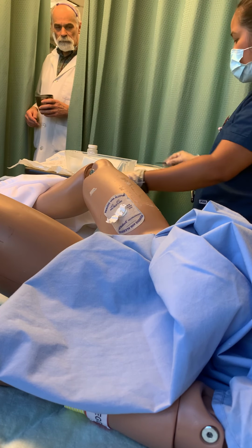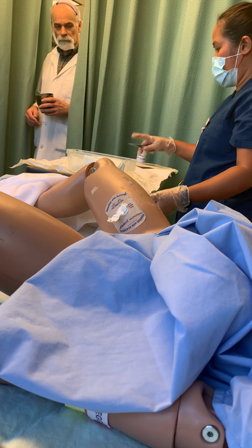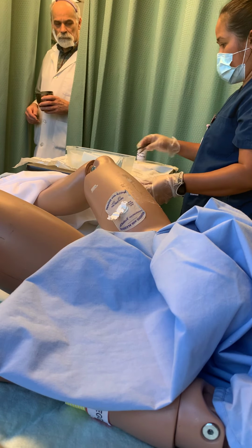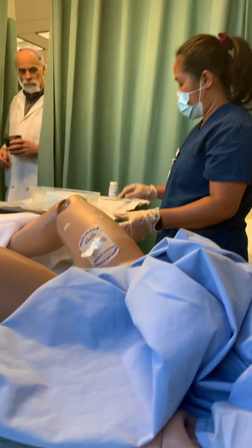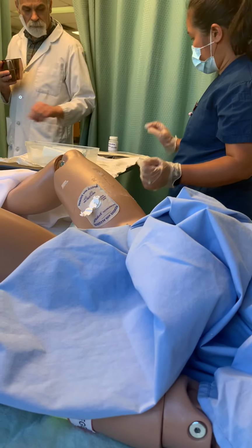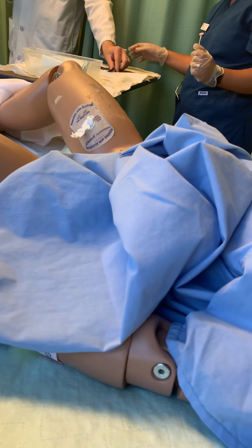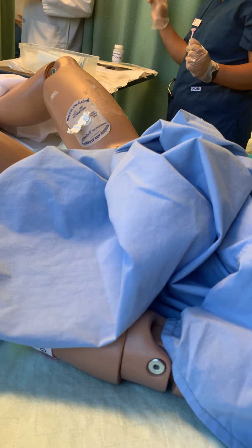This one, always adjust. The 1 inch border is already contaminated, so be careful about it. Now you can put this here, half of it, because you're going to be holding up to here. It's contaminated up to here, so you can only put in the stuff that's uncontaminated.